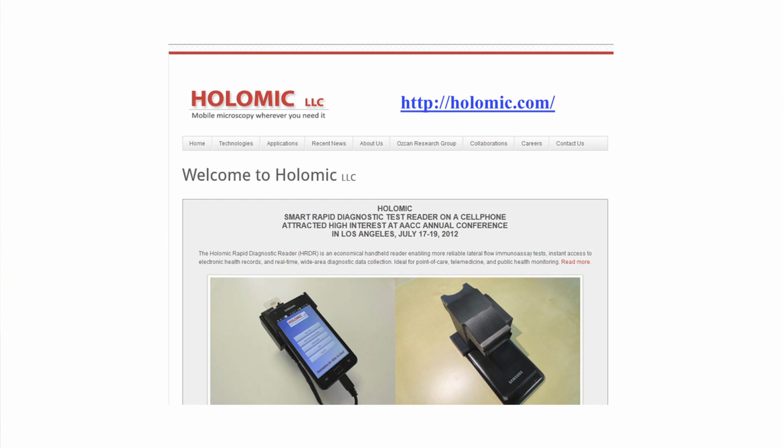One example that I'd like to give you is this universal rapid diagnostic test reader, which is essentially a platform for reading and quantifying different lateral flow tests. Whatever you use for malaria diagnosis or HIV tests or other sexually transmitted diseases or OV16, you can actually use these for quantifying very accurately, whether it's a nanoparticle-based lateral flow test or a fluorescent-based lateral flow test. You can quantify these using these attachments.